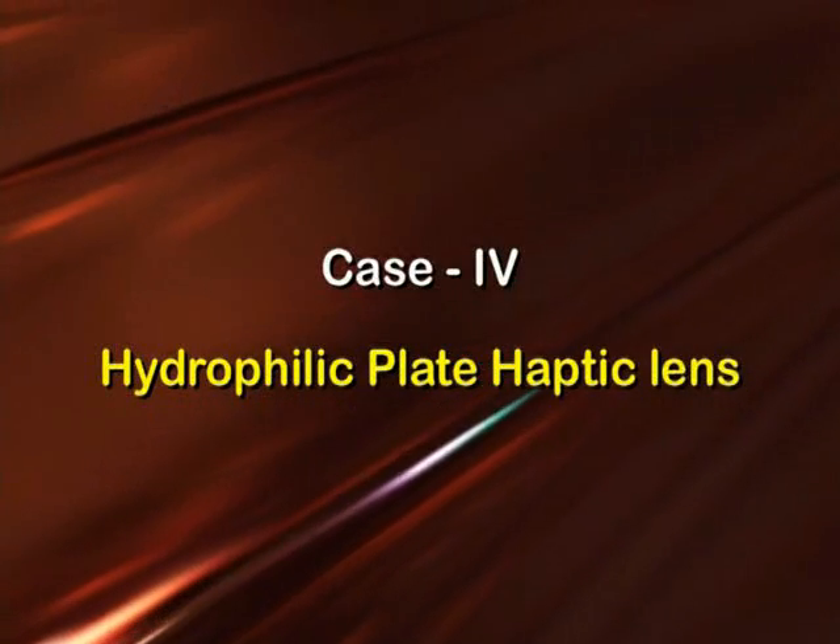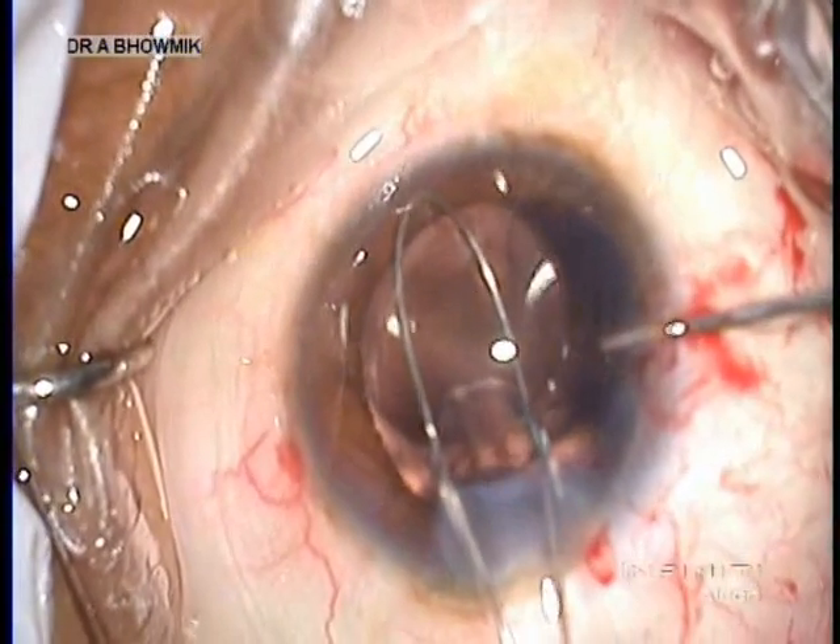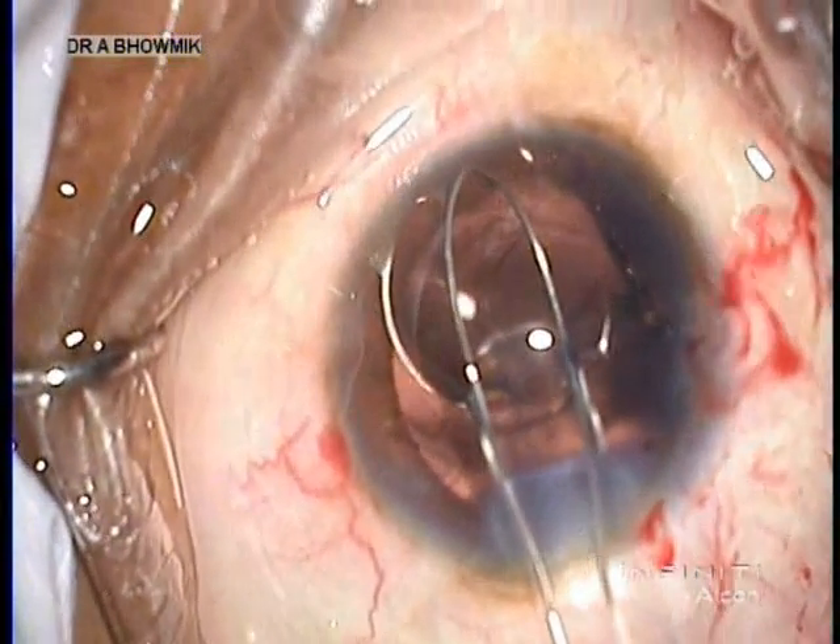A similar technique was followed for the explantation of a hydrophilic lens with a plate haptic design.